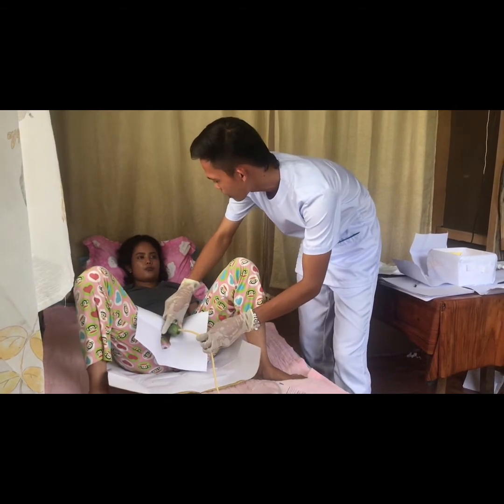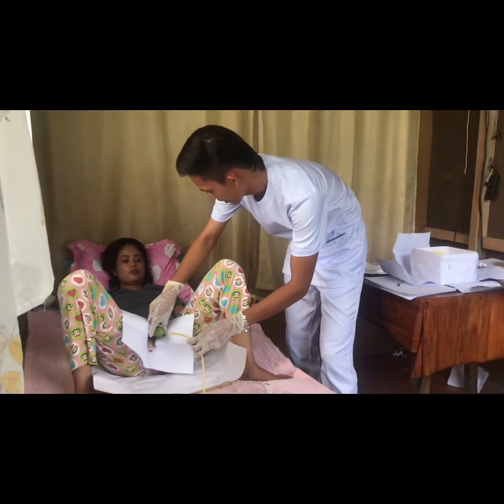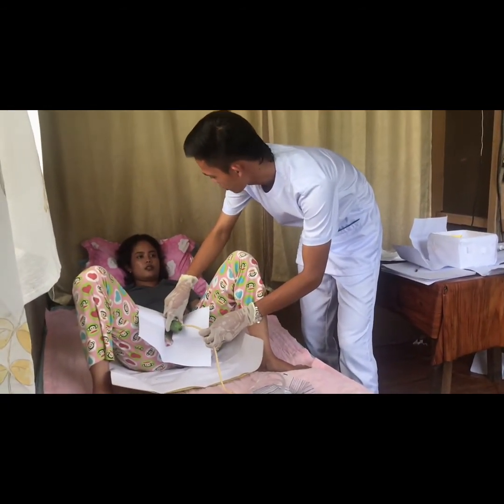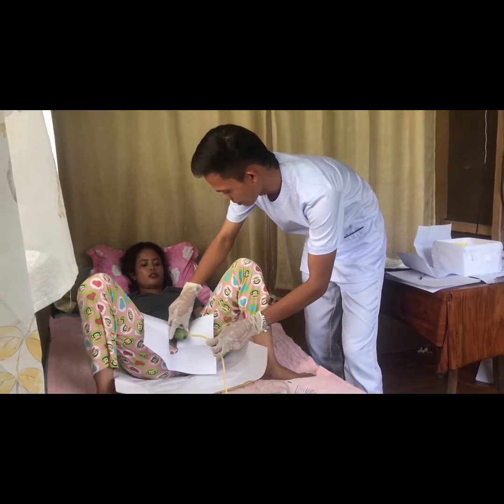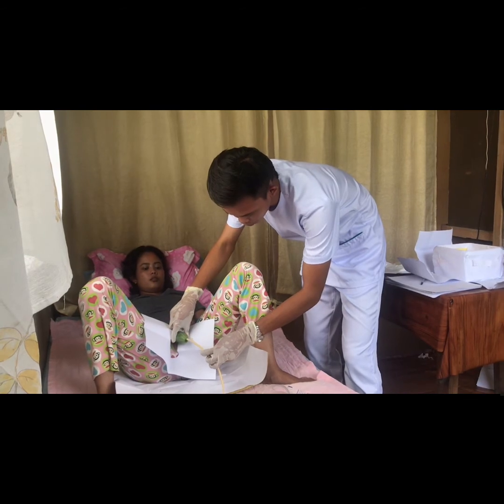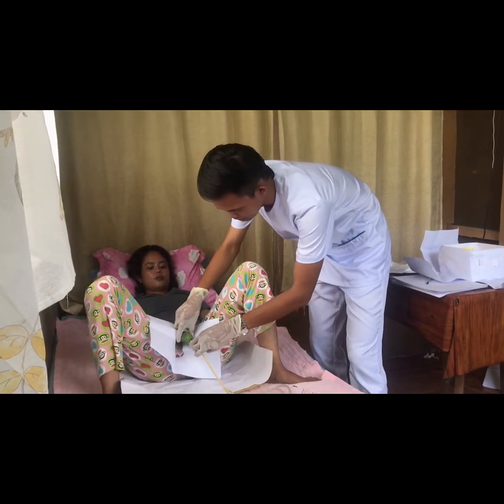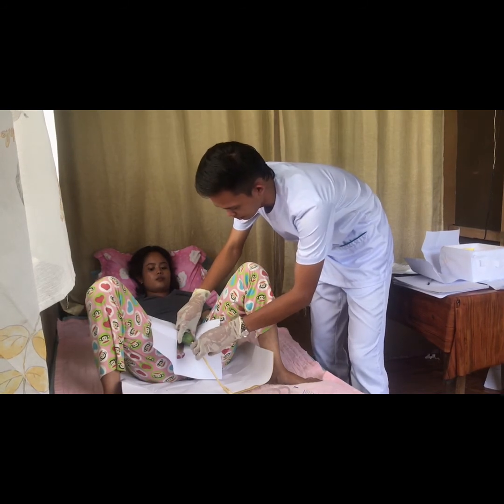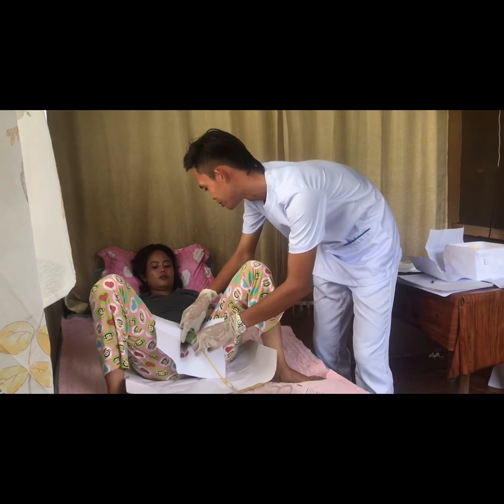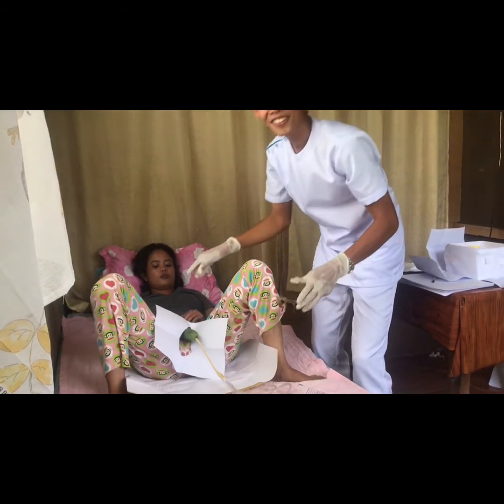So are you ready, sir? Yes. I'm going to insert in 3, 2, 1, and you have to inhale and exhale, okay? All you have to do is exhale while insertion is ongoing, okay? Okay, so please take a deep breath. Okay, ready for insertion and 3, 2, 1. Please exhale, inhale, exhale. Okay, good. Okay, all is good. Okay, very good.